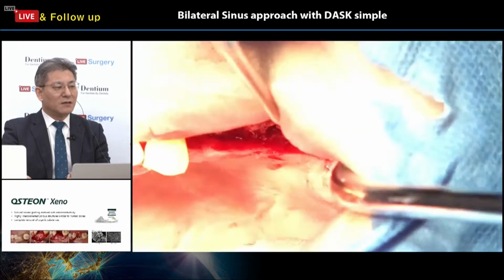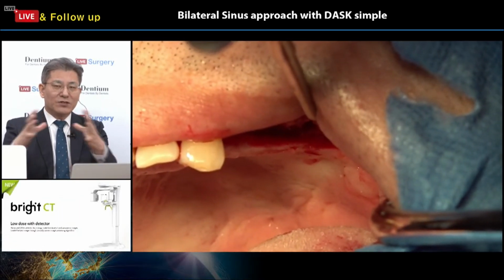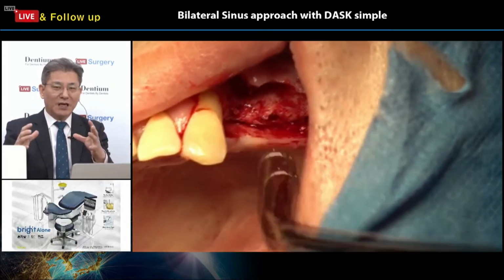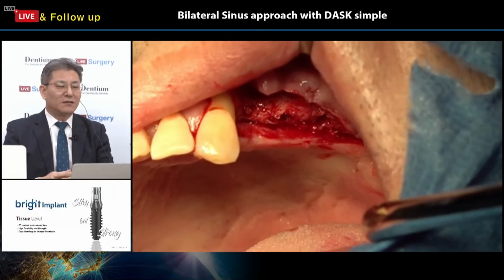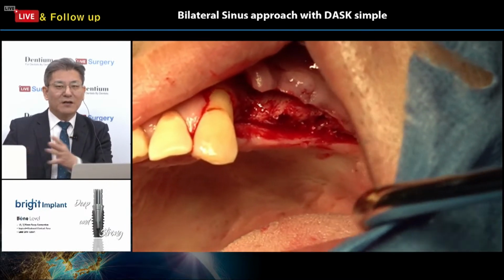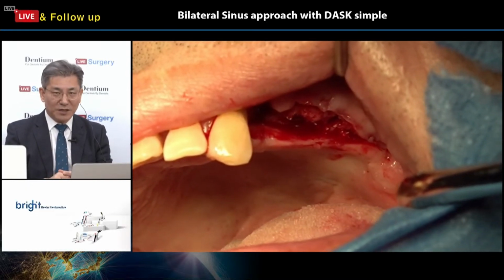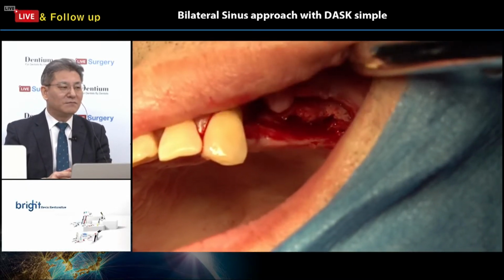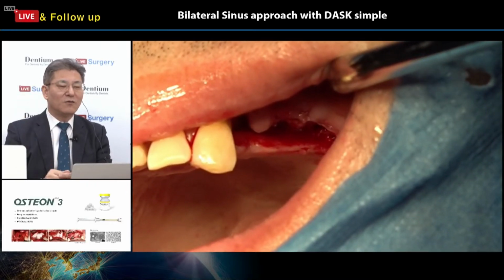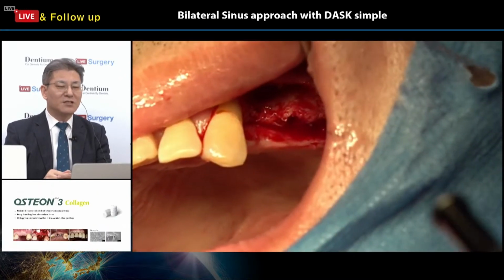Okay. As you know, the tissue level of bright implant, the top portion and platform is a single platform, 3.8. Even though from the smaller diameter until the wide diameter, the top portion of the platform is the same, 3.8 millimeter. And the gingival height is 1.5, a single gingival height.